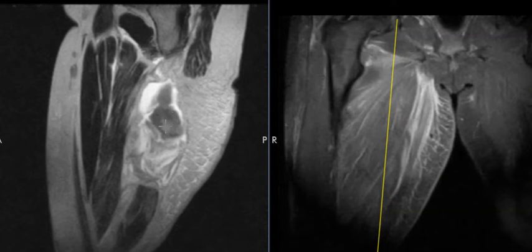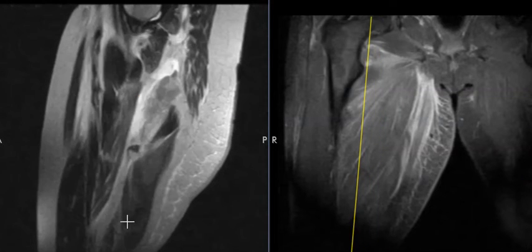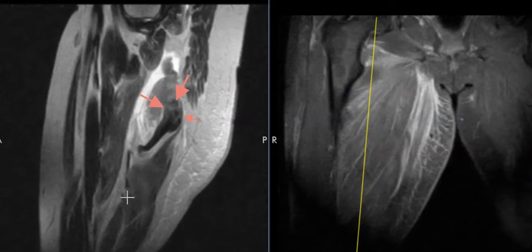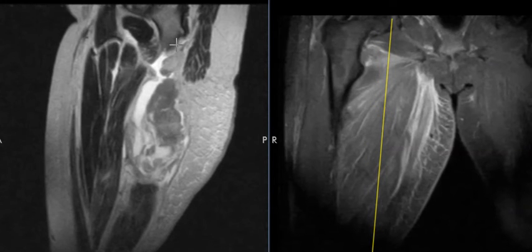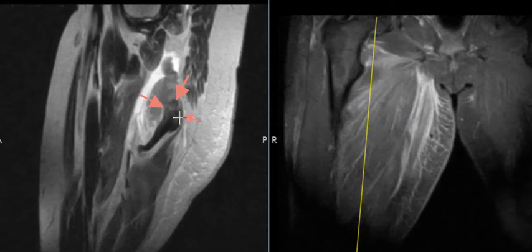And we see this glob down here, the hemorrhage. This is the muscle back here. And this is the tendon. You can see the muscle down here. This is one of the tendons coming up here, making a little loop. Coming up here, and here's the torn tendon end, this glob here. And again, it should attach right up here on this bone, bony ridge. Instead, it's pulled back down to about here.